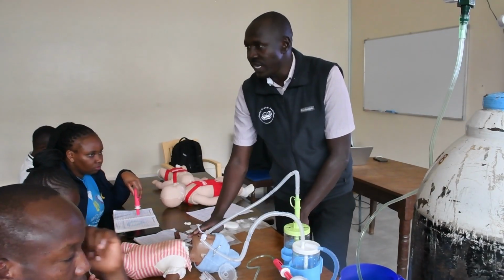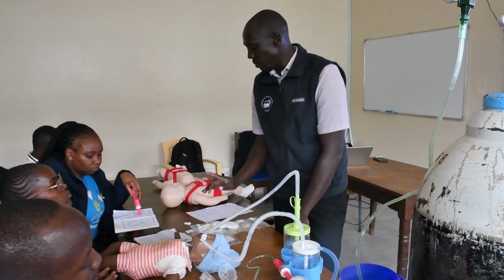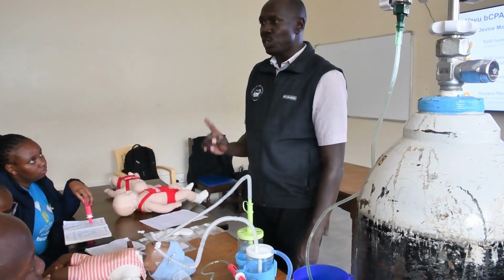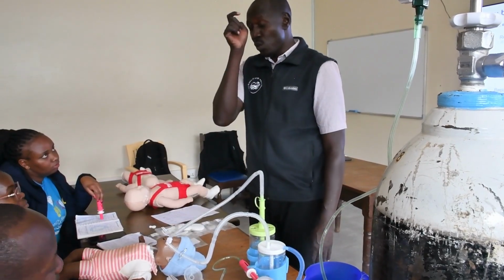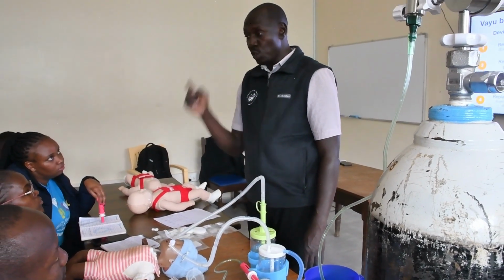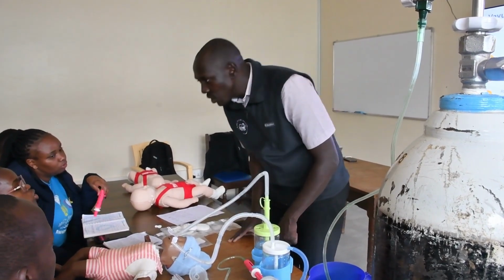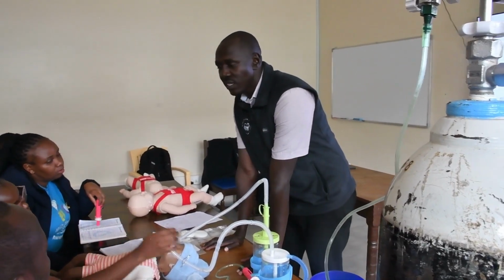If the baby needs feeding, let the baby feed. I think we did mention how to insert an NG tube for this baby. So a baby on CPAP, do you put an NG tube or OG tube? OGT or NG? Huh? OGT. Why not NGT?